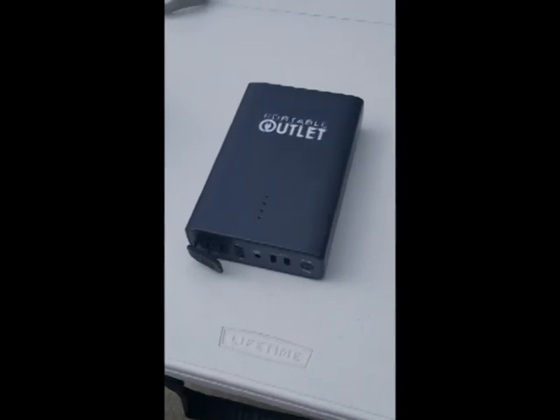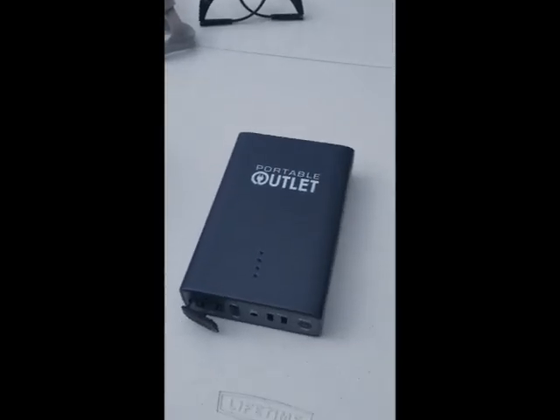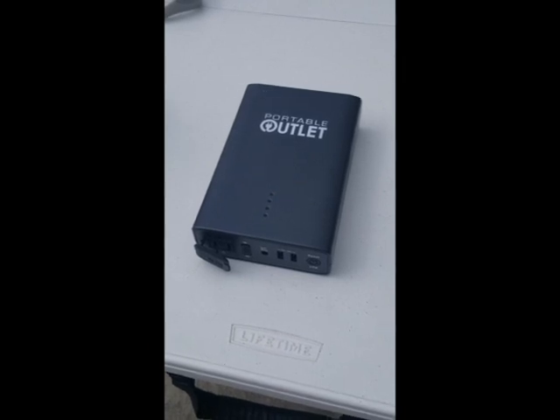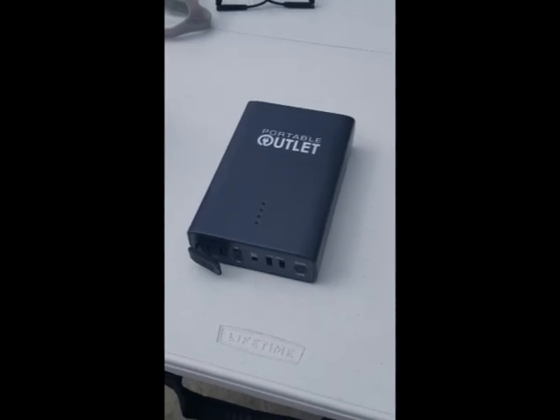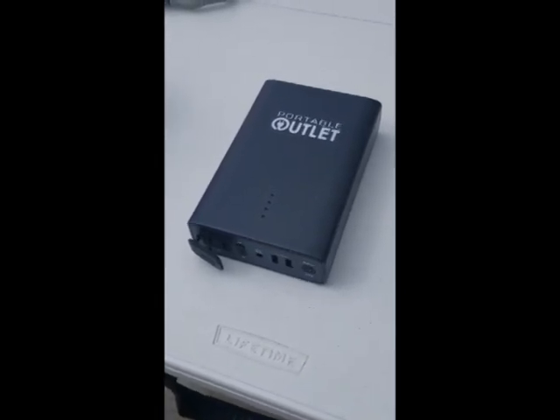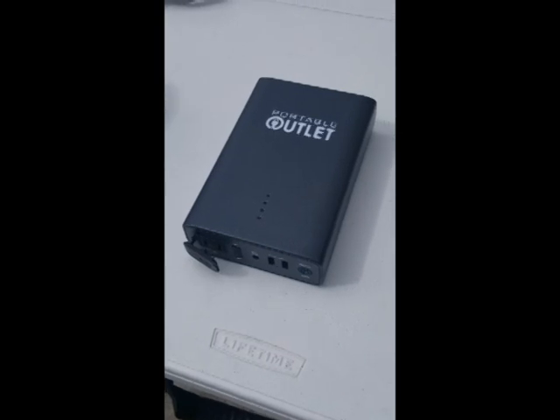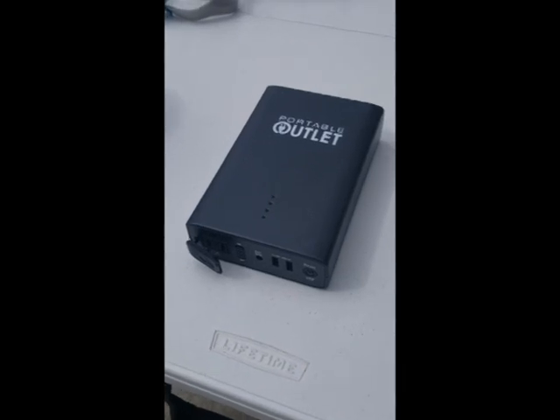If we just use the CPAP machine as-is, you'd be stuck to the wall. You'd only be able to move around the house, and there's no point in that because hopefully everybody at home is well and you don't need to be protected from each other. So to allow us to move around, you need a battery pack — a battery source of some kind. This right here is a battery pack for a CPAP device, but I've also seen them made from 18650 lithium cells. There are many other external battery sources you could use in conjunction with the CPAP device.